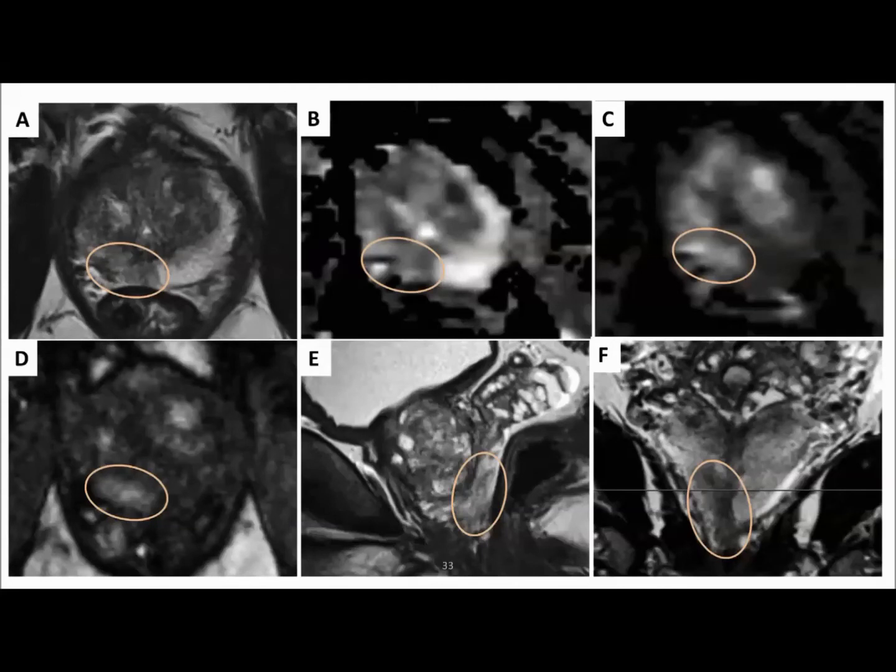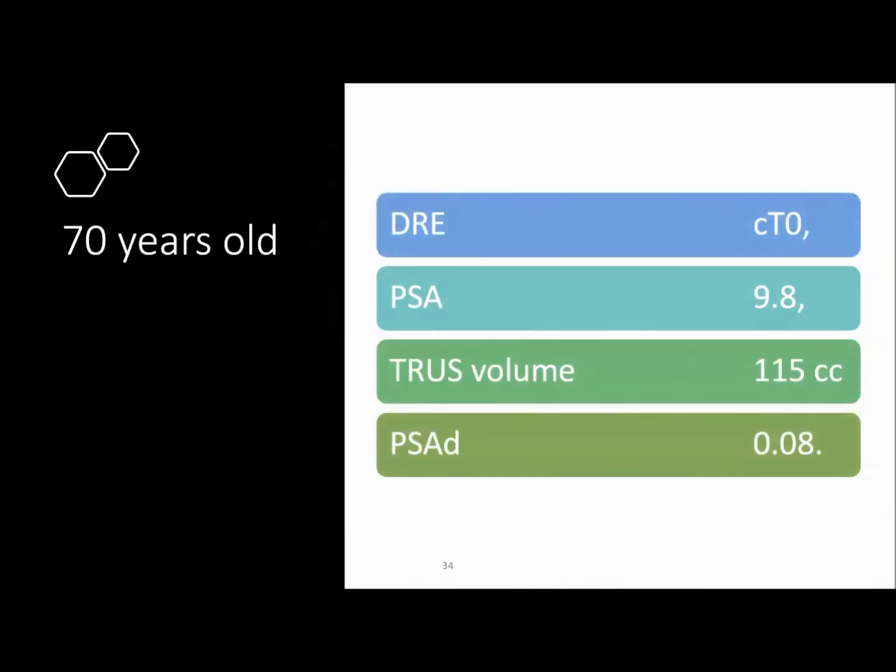So thank you very much, Dr. Shayan, for this very nice description of differentiating between prostate cancer and prostatitis. So we move on to the next case.